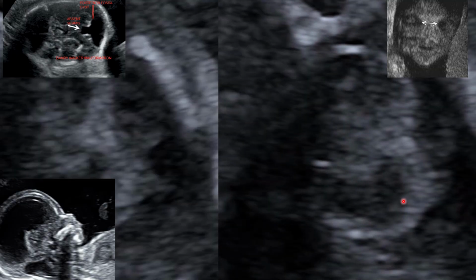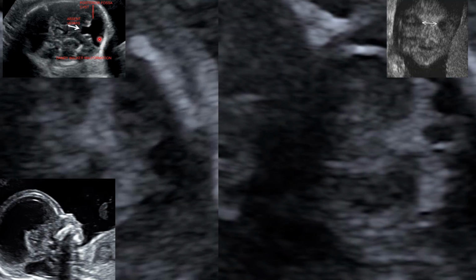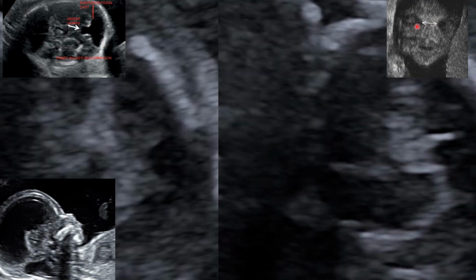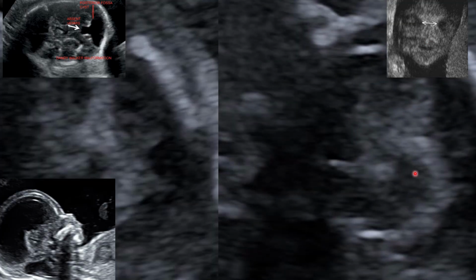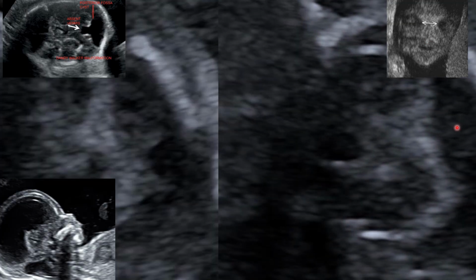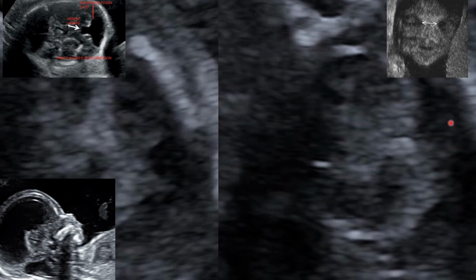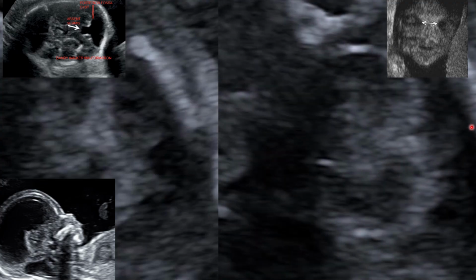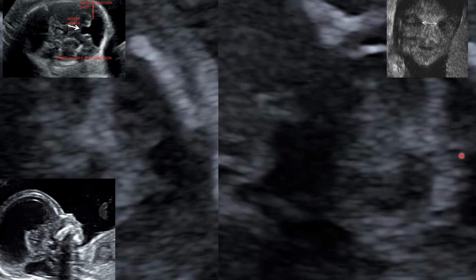So keep in mind how to check for Dandy-Walker malformation and hypertelorism. You use the cerebellum and the cisterna magna. Check the vermis and the cisterna magna measurement. Is it elevated, or is the distance normal?